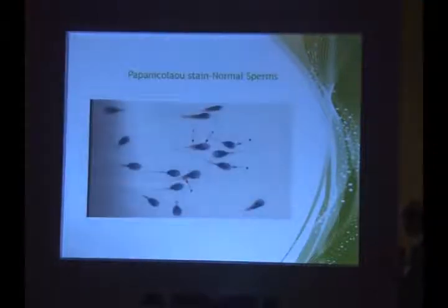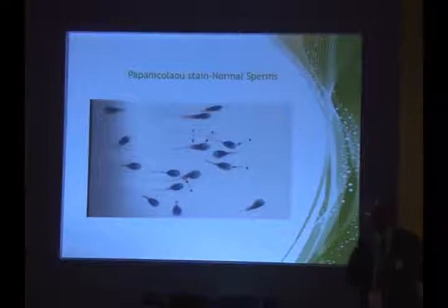Now this I am going to take some time. This is a population of normal sperm by Pap stain. Now how do we define what is normality? I told you that the normality reference range is the population of sperms obtained after a coitus from the internal os of a woman. If I take 100 women and obtain, and if I see these are the majority sperms, I take that as a reference point.